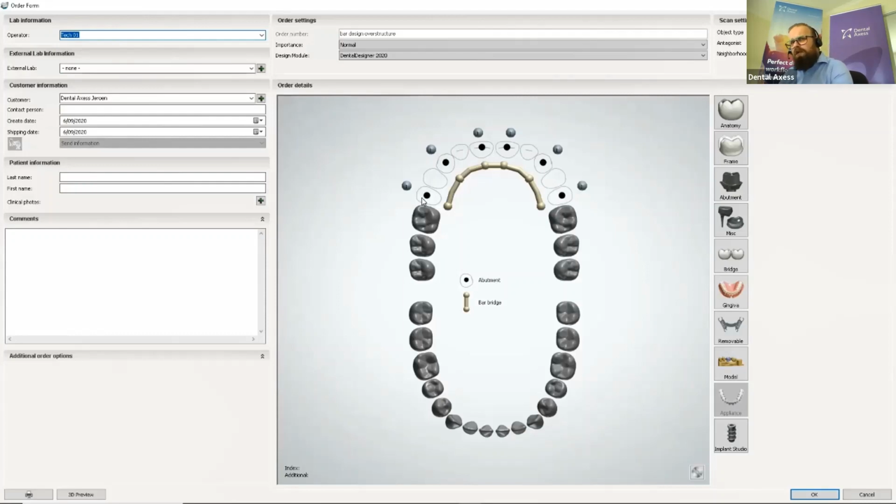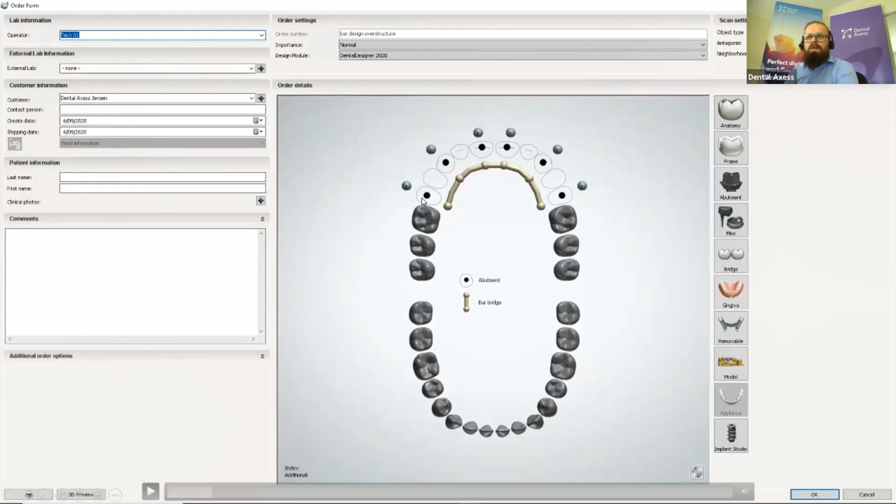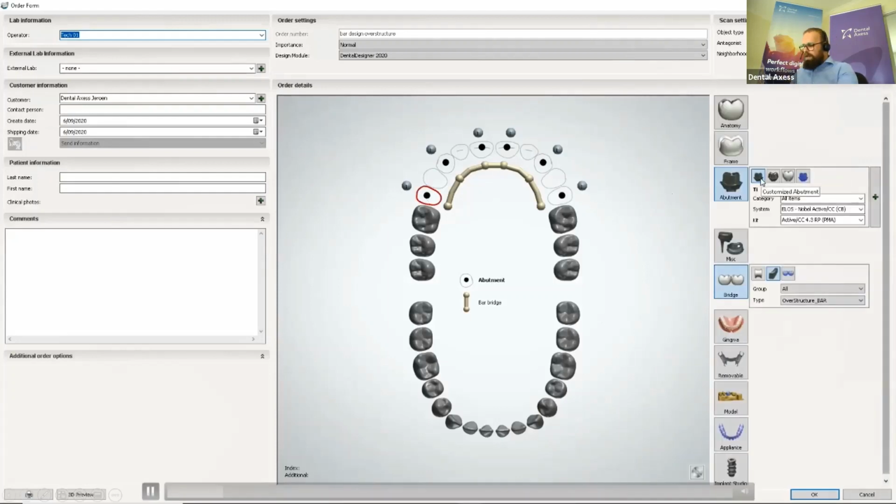A lot of times you already start with a patient who has a denture, for example, or it's going to be extractions and then directly creating something on that. So we created that up front to make it a little bit easier and the designing go faster. That is basically copy, append, design. Also one of the functions will be anatomic for reuse, or basically design for reuse. So we go from that point, this we already have.